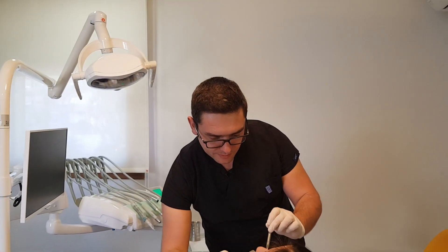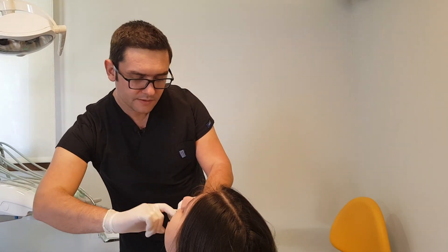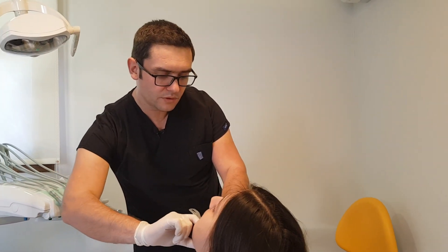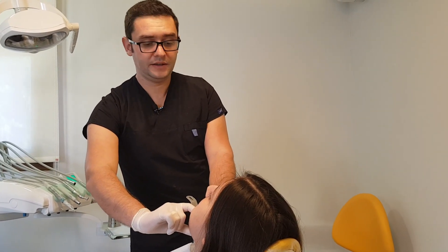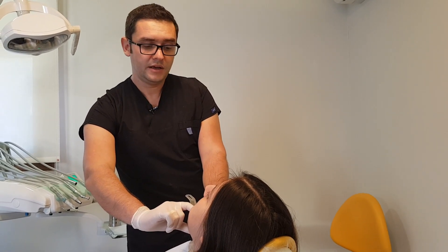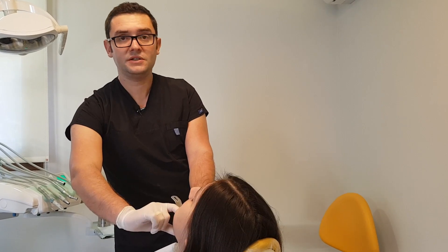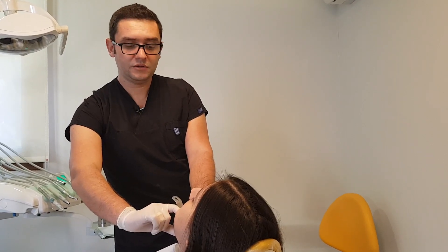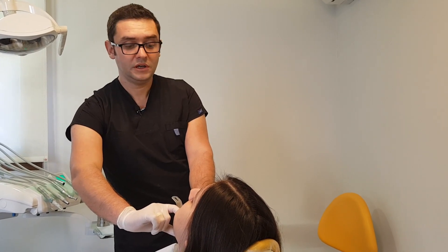Okay, open please. Now I place the impression tray over the teeth. I press gently. And now I am waiting for a few minutes until the impression material is set. This part is very important. If the patient moves or if I move the impression tray a lot, the impression will not be correct.